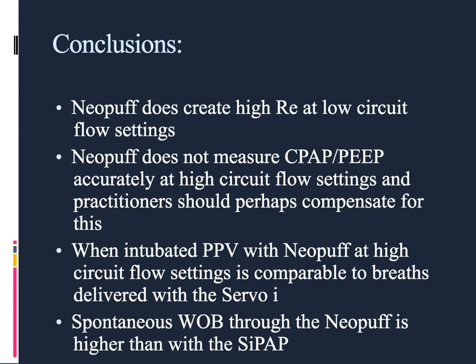So in conclusion, I just wanted to state that the data that I've presented to you today has not been peer reviewed. It has been independently verified by some institutions like the Foothills Medical Center. So they've seen some of these same observations. They haven't generated the same kind of detailed graphs that I have, but I do believe there are some other researchers looking at that. We just have not published our data at this time.